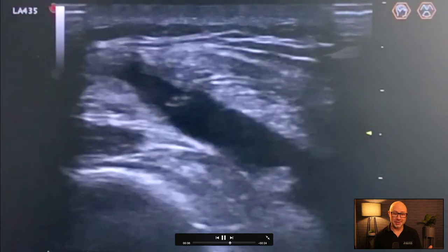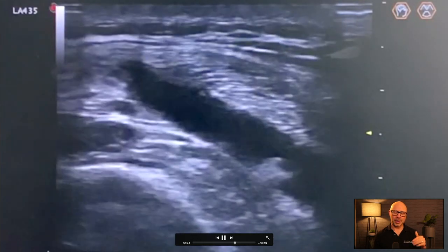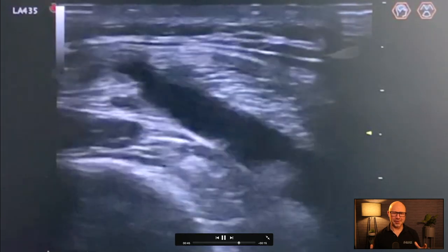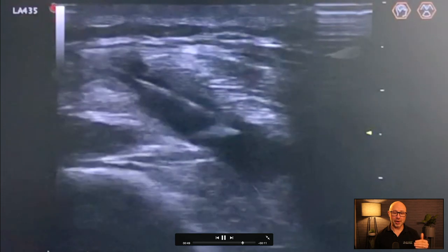You'll see the end of the needle there — the nice sharp beveled end — as we work it into the area where there's fluid. We lose contact there, which was horrific, but that was just while I was trying to get a bit of a better image. Then we find it really well there.